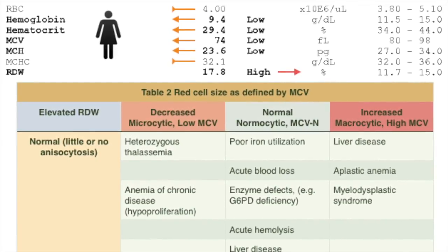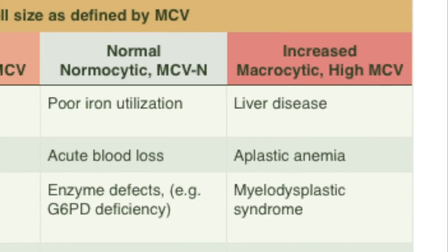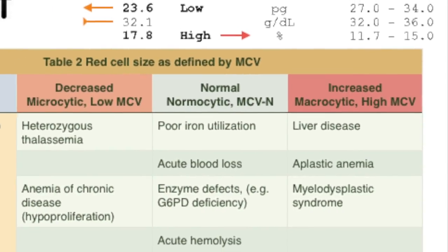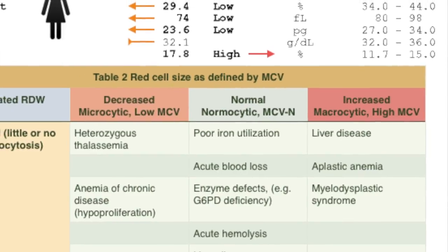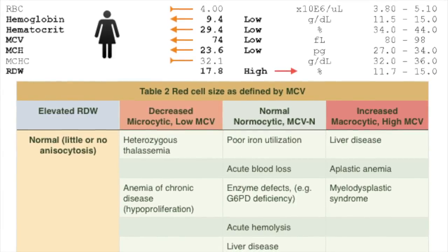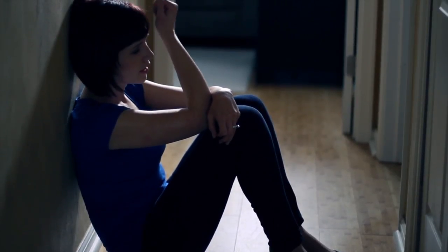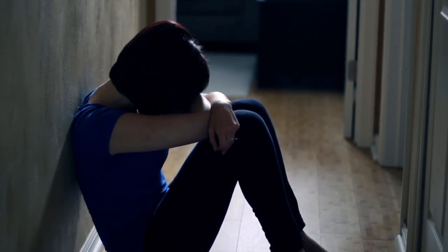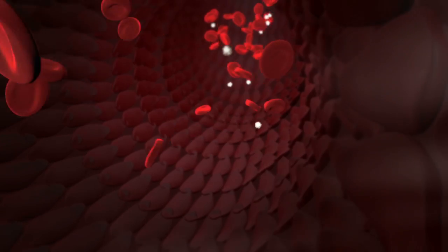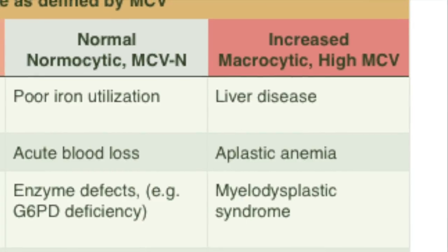hemolysis, or liver dysfunction. While normal RDW on the high side with high MCV may indicate liver dysfunction or developing bone marrow dysfunction with impaired blood cell manufacturing. Where the fact of the matter is, if the patient is reporting fatigue, brain fog, and muscle aches and pains, yet their red blood cell indices are not significantly out of range, the assumption is that the blood cells are being properly manufactured until it gets to the point where the indices are finally severe enough to be out of range. But most never get to this point.